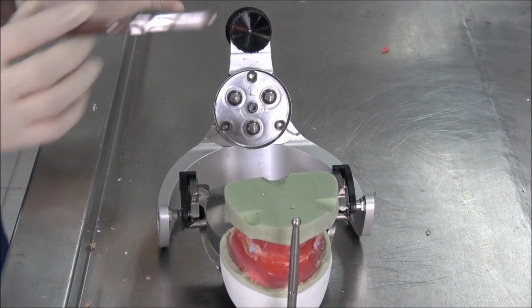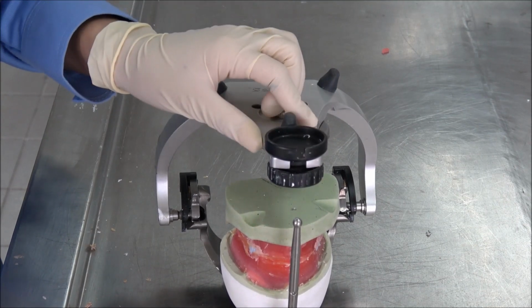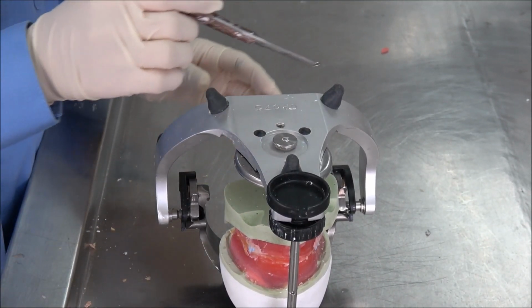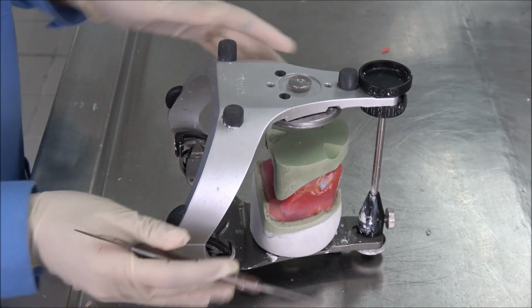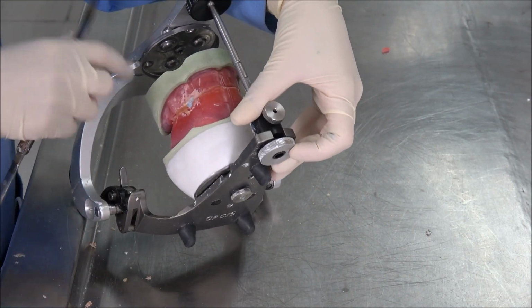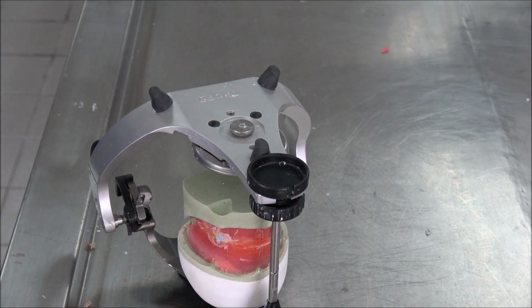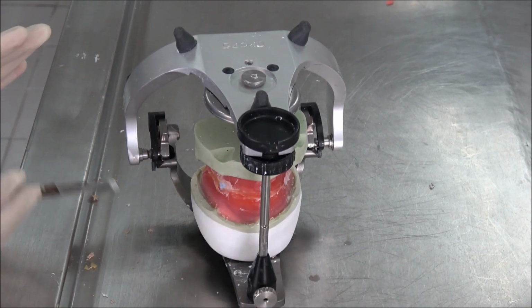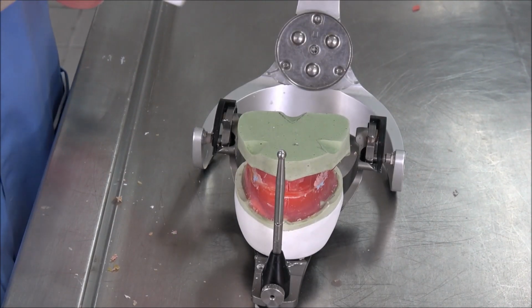Before we start mounting our lower models, we have to check our articulator here. Everyone, can you see there are a few rubbers around the articulator, on top, upper and lower. These rubbers are to stabilize our articulator to prevent moving and to make sure it is parallel to our models. The same goes for the lower models.